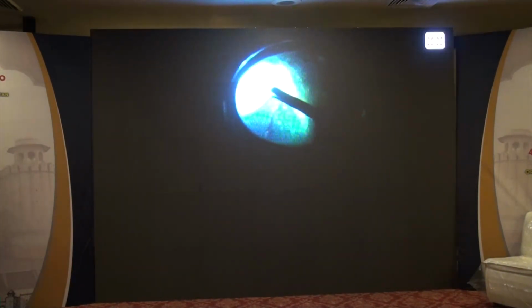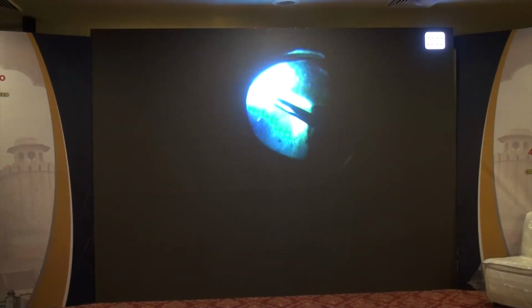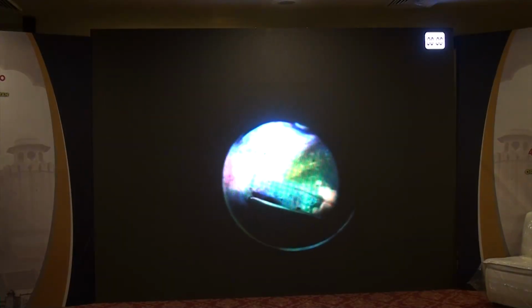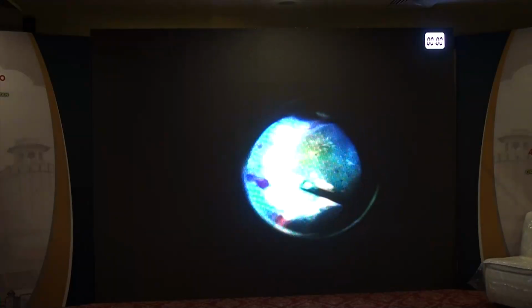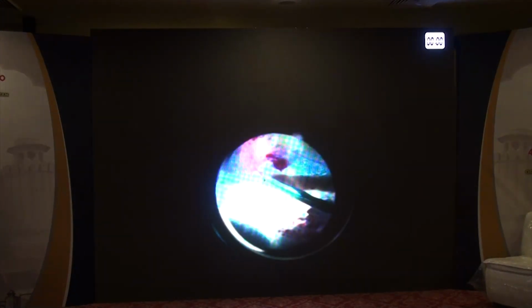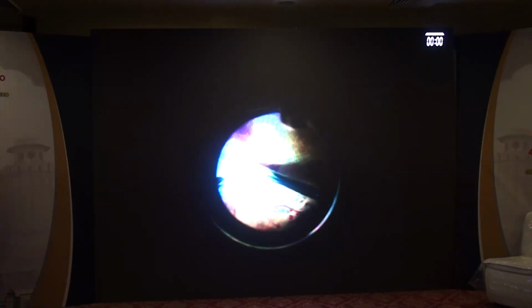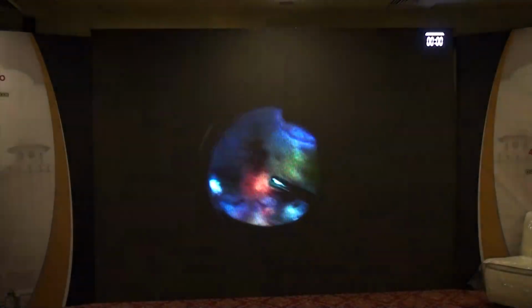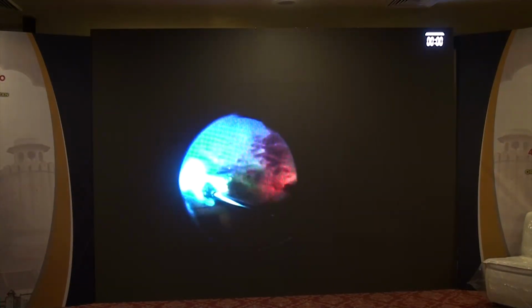But then the other important thing is not to lose your calm. I'm not a very big fan of using perfluorocarbons in retinal surgery unless you have giant retinal tears. So I find that if you can manage without the use of perfluorocarbon, it is probably a good idea. Now the macula is beginning to sit, and the elevation looks a lot better.